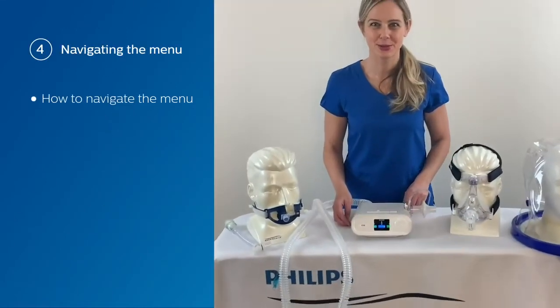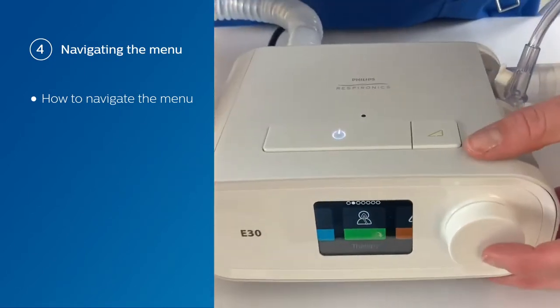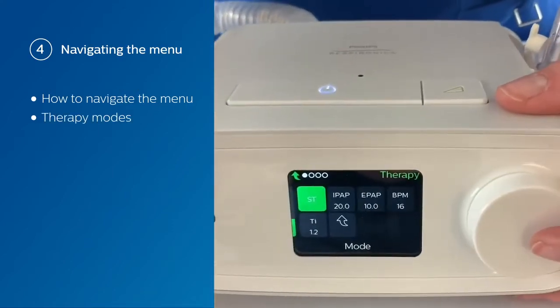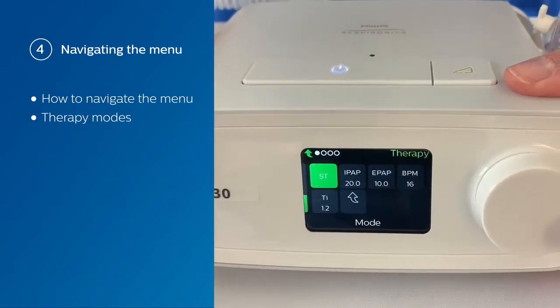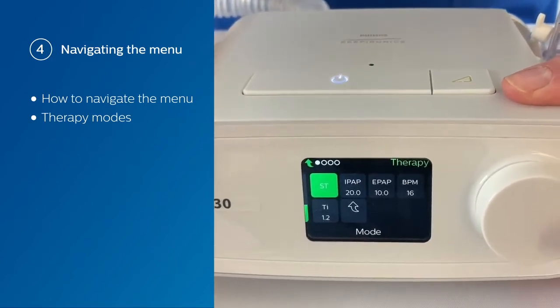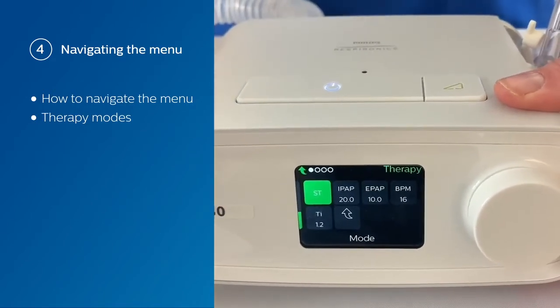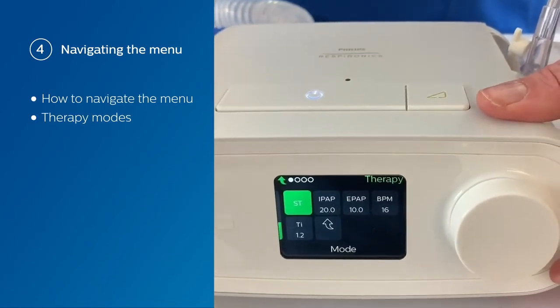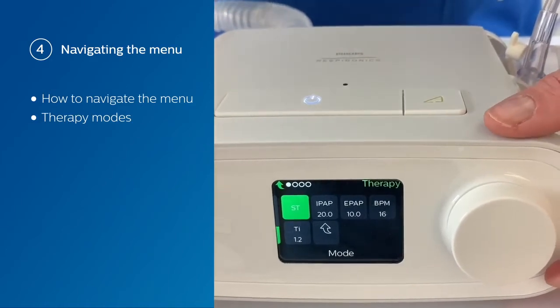Now we're going to go through how to navigate the menu. Use the control dial, select therapy, and you can see all of your different therapy modes and options. Currently we're on ST mode — a spontaneous timed mode where you set an IPAP and an EPAP. The difference between IPAP and EPAP is your pressure support. You also set a breath rate and an inspiratory time. This breath rate is only active if the patient ceases to breathe spontaneously within the time window, and they will get a timed or mandatory breath based on the inspiratory time.